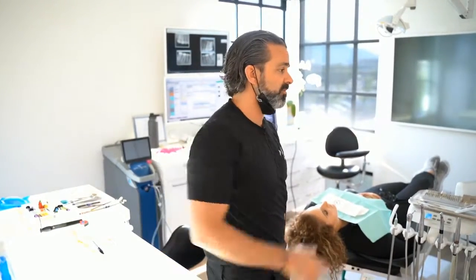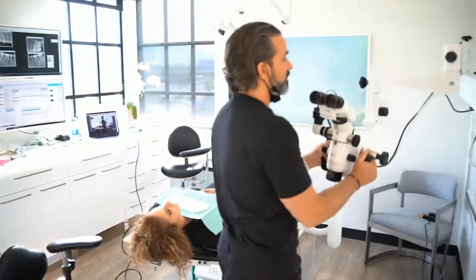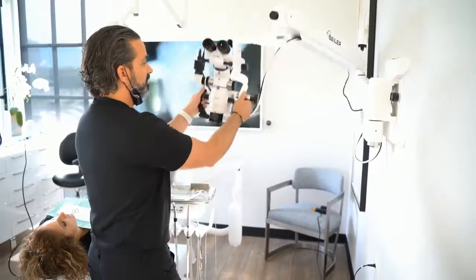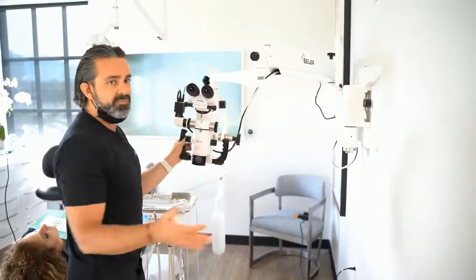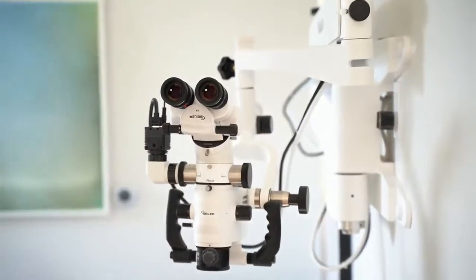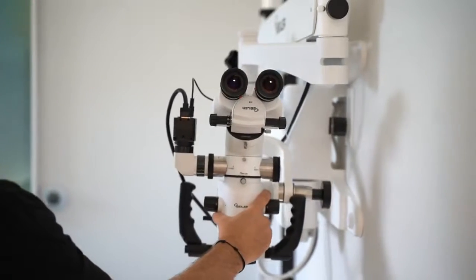Once you get comfortable with how to focus and you get comfortable with positioning, you want an arm that articulates very well, and you want an arm that, when it's there, it's there. It doesn't go up, stop, drift. They can all be balanced out, but there are certain arms that balance out better than others. So that's another selling point for this company.